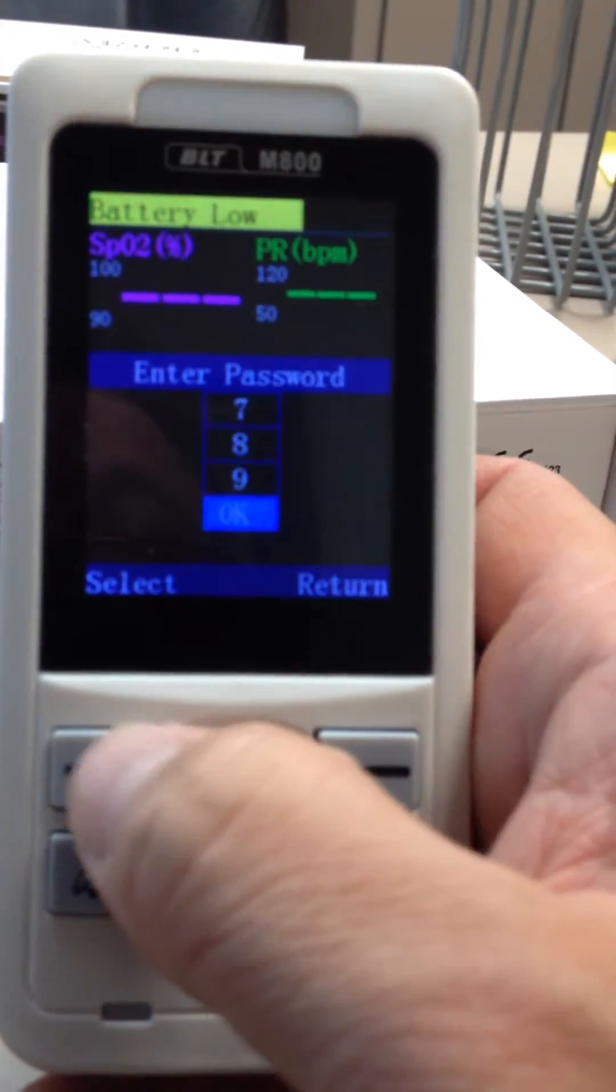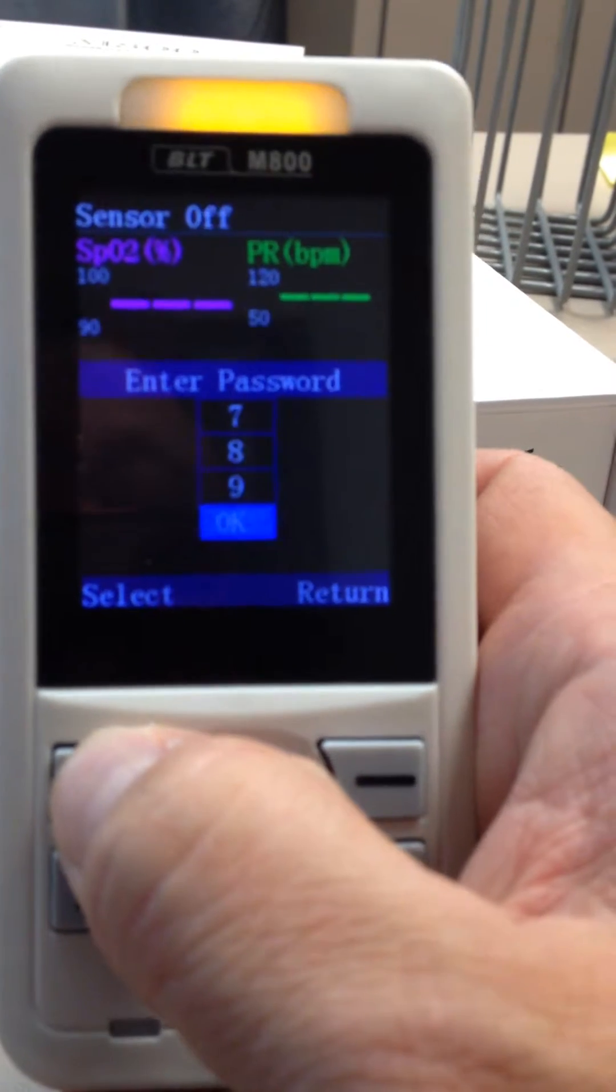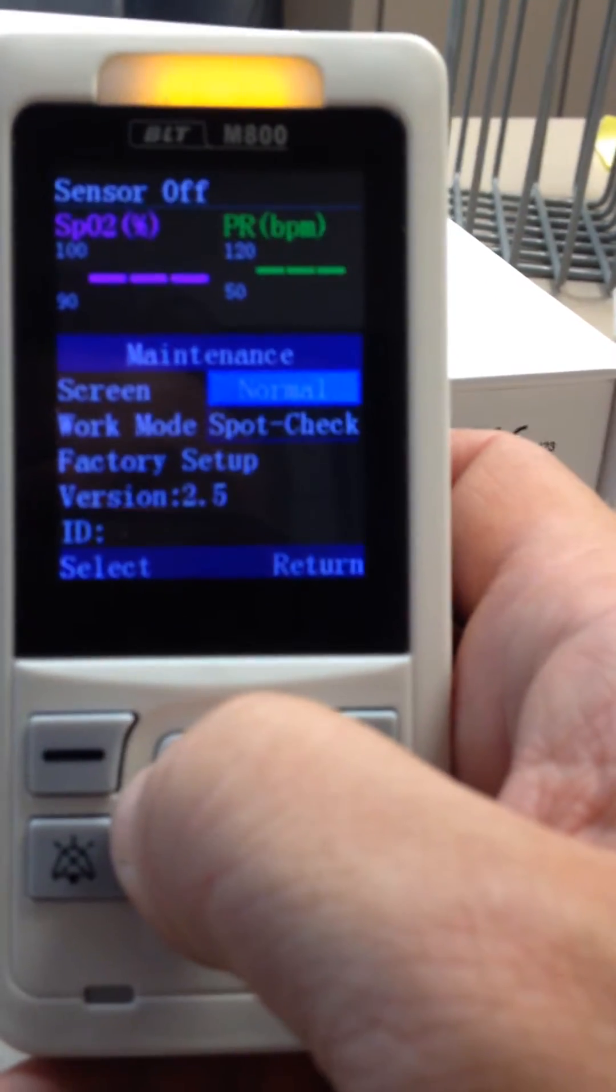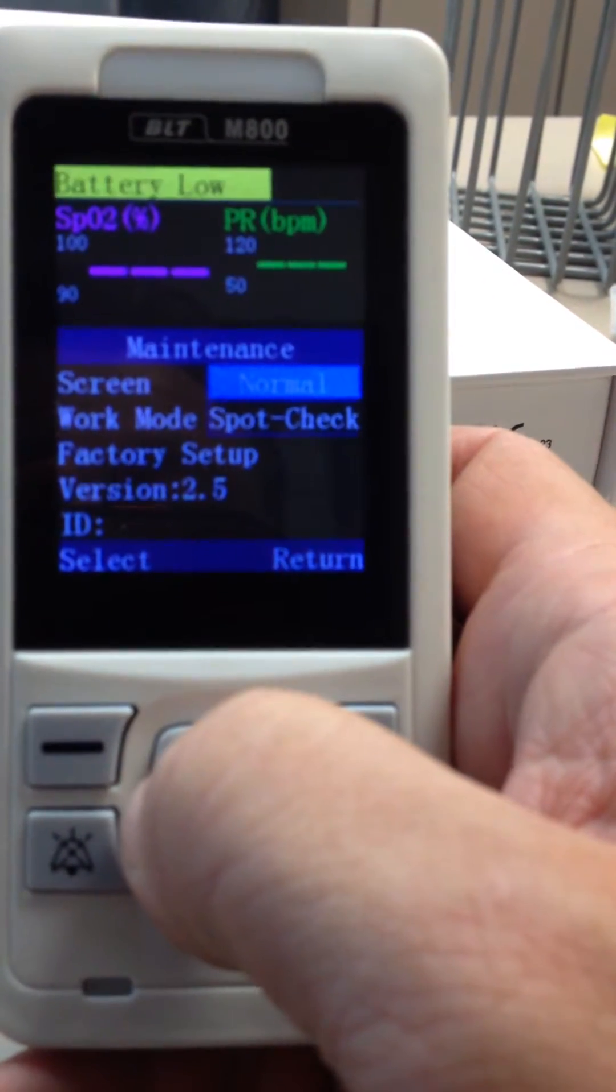Go down and click OK to access the maintenance menu.